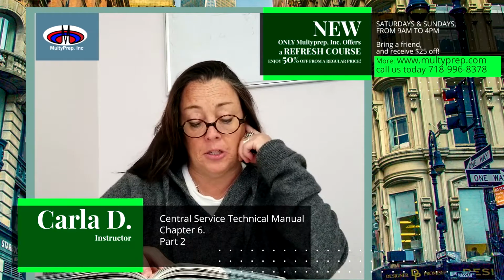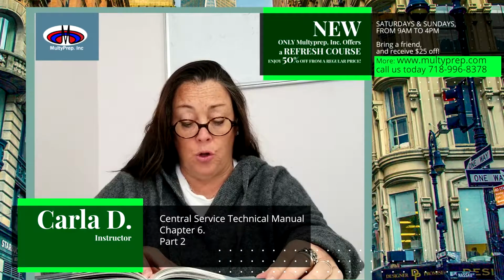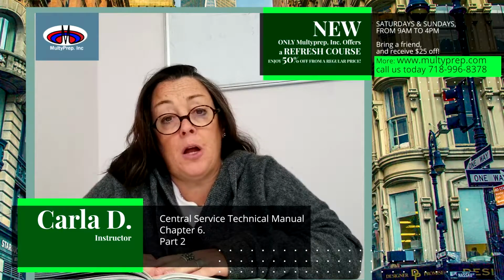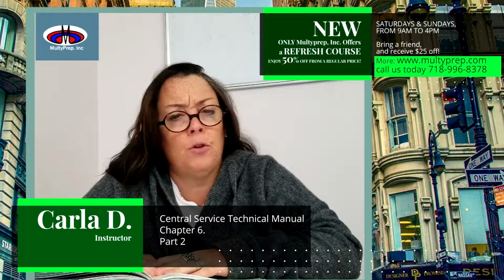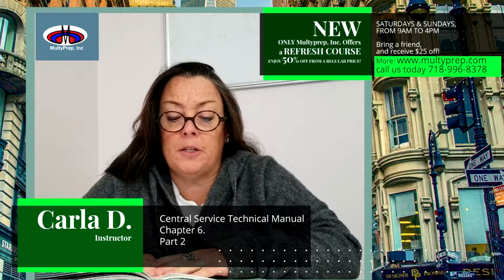The area designated for sterile storage may consist of either open rack or closed cabinet storage units. The decision about the type of storage used is based on the types of items to be stored and the amount of traffic in that area. For example, closed cabinets may be used in high traffic areas, and open shelving racks may be used in more controlled low traffic areas. Open rack systems should have a solid bottom, so items stored on the lower shelves are protected from contamination during housekeeping tasks.